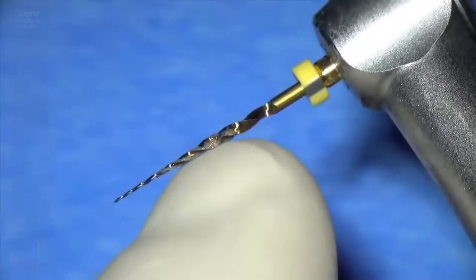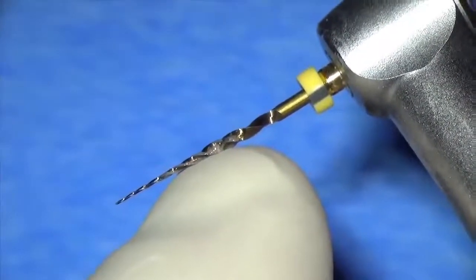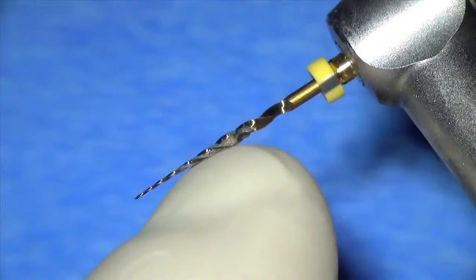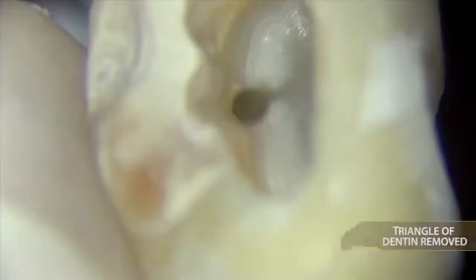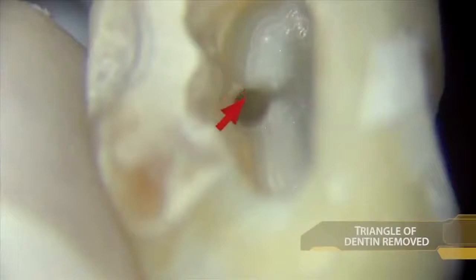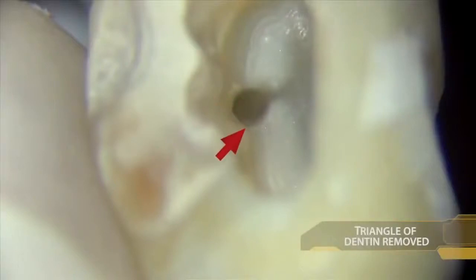We simply paint away that dentinal triangle. You can see the dentin removed from that triangle in the blades of the SX. Instead of the dentinal triangle, we now have a tunnel that we can easily follow.